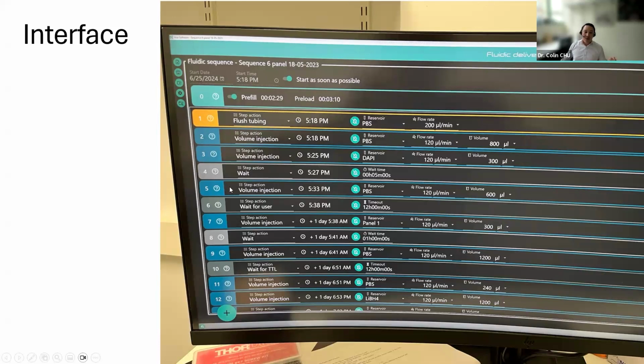And then this software would readily interface with the microscope software that would wait for what we call a trigger to then bounce back and forth between both the fluidics, essentially doing the staining, then notifying the microscope to commence its imaging. It takes the images and then sends a signal back to tell the Aria to continue to the next stage, where it would bleach, wash, and then stain the next panel, and so forth and so on. Essentially, what this would allow us to do would be to stain 6 to 8 rounds, once you've set it up overnight, and go away and leave it to work.